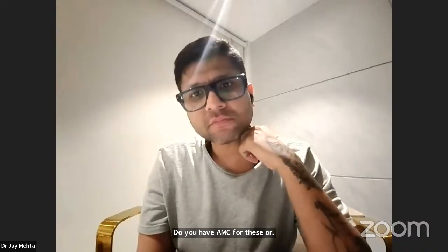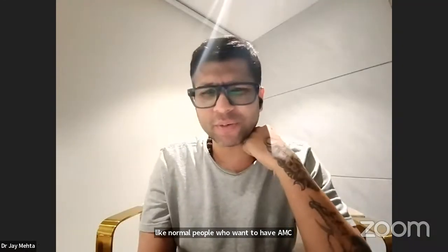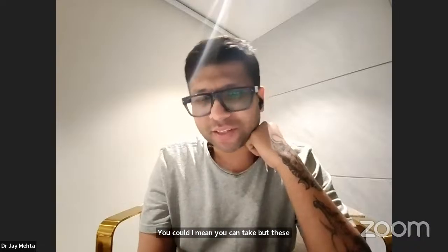So, AMC, what is your take on the AMCs for these incubators? Do you have AMC for these, or only the time lapse as the AMC? I don't have AMC, madam. No, not you. I mean, normal people who want to have AMC. You can take, but these incubators don't really get spoiled so easily. If they get spoiled, a lot of motherboards are available in the gray market, much cheaper than what these people sell. So it's not a big deal.